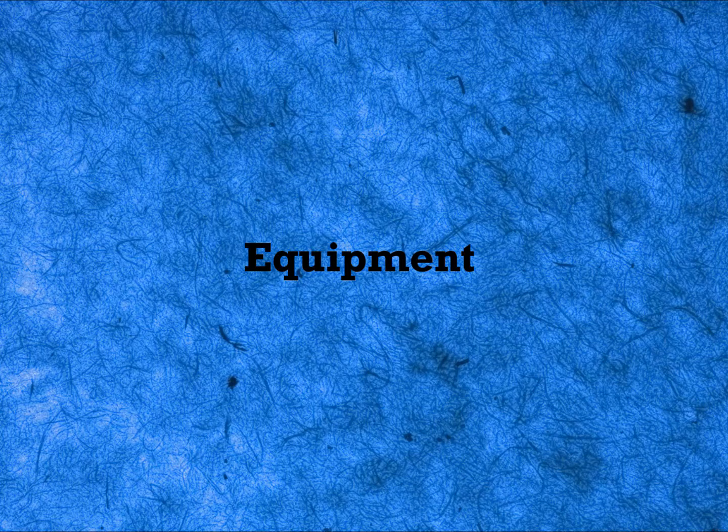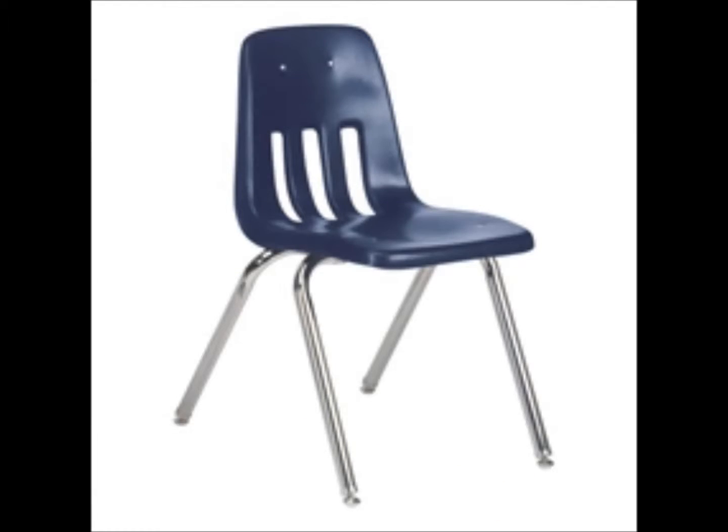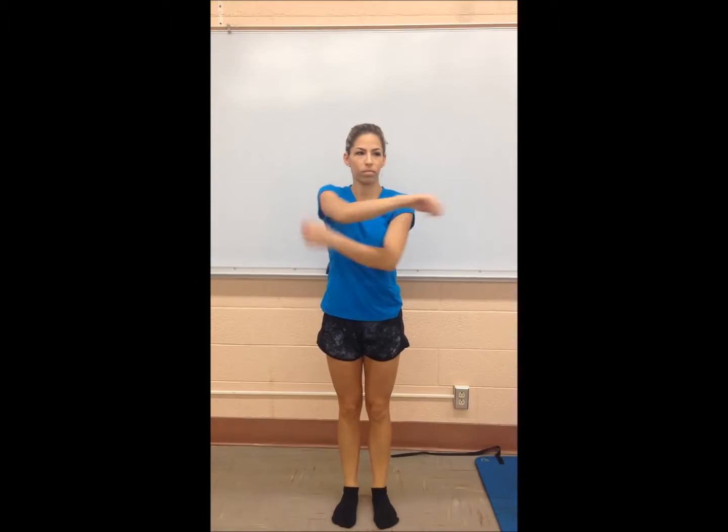The equipment you will need are a standard sit and reach box, a mat, chair, yardstick, ruler, and a goniometer. Have your subject start off with a 5 to 10 minute warm-up of moderate intensity, followed by light stretches.